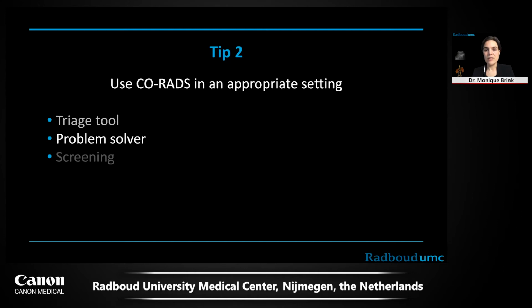Second, CT performs really well as a triage tool, but there are cheaper alternatives, and for this reason, we're not using CT anymore for that, and we only leave CT now as a problem solver, although we don't know yet how good CT actually performs in this situation.